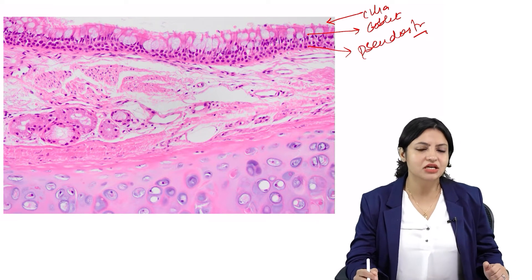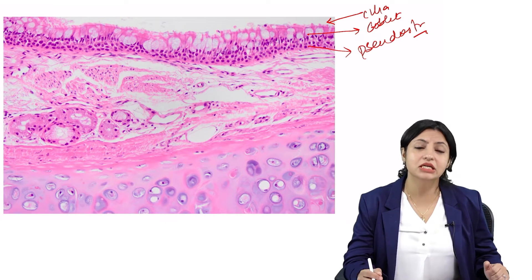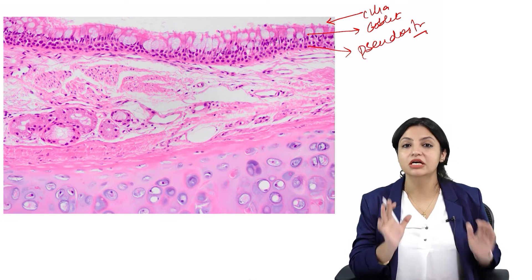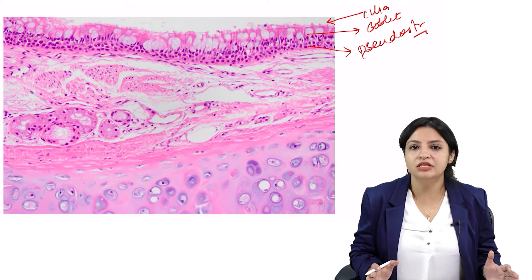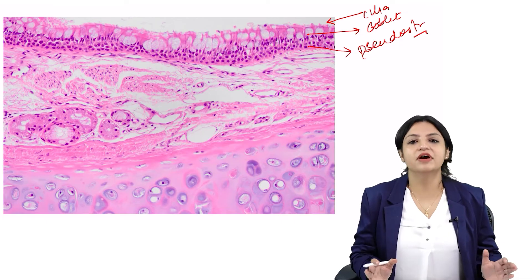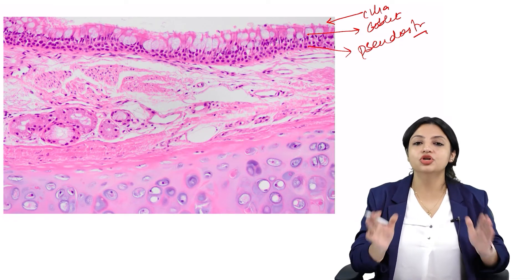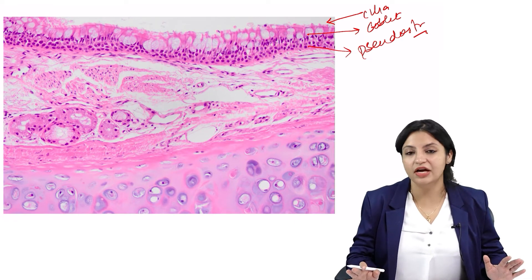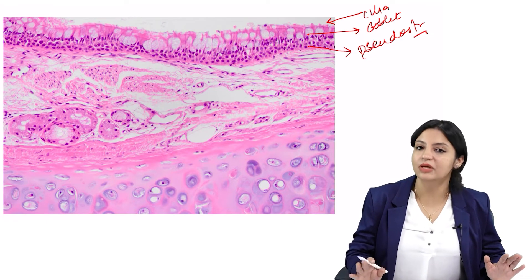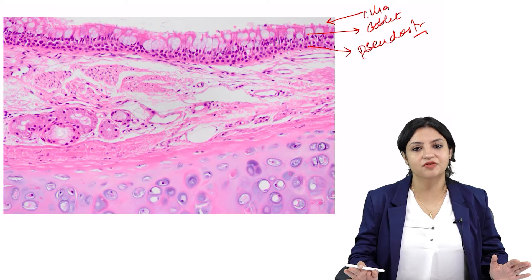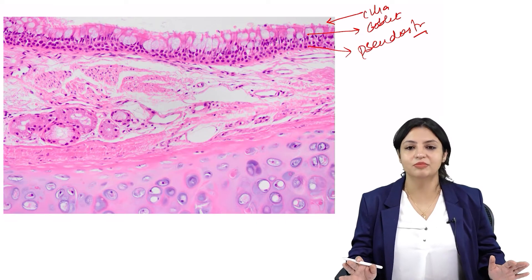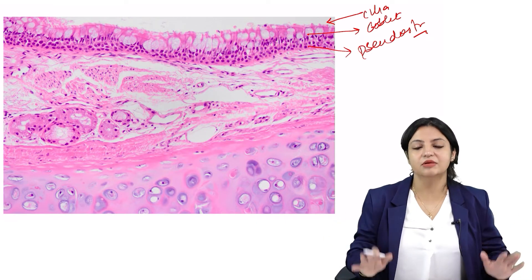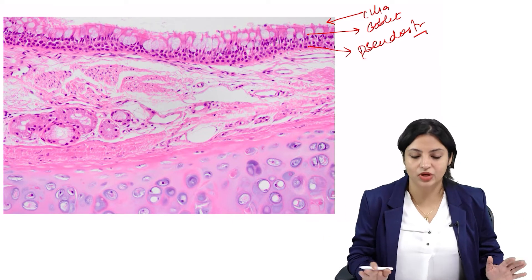Pseudostratified ciliated columnar epithelium is seen in respiratory tissue, so this is probably respiratory. The first point is identifying the parent organ — your parent organ has been identified. It's respiratory epithelium.